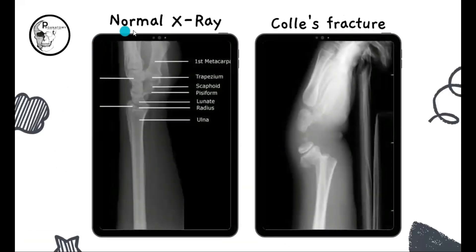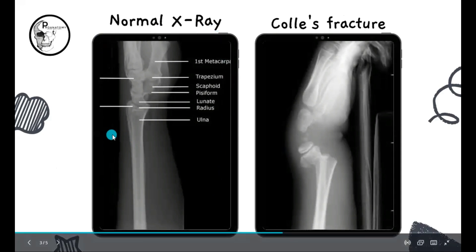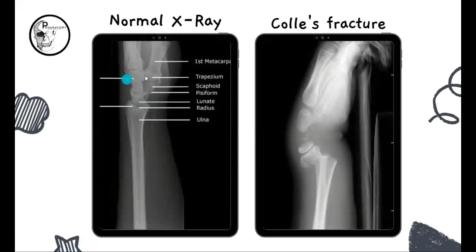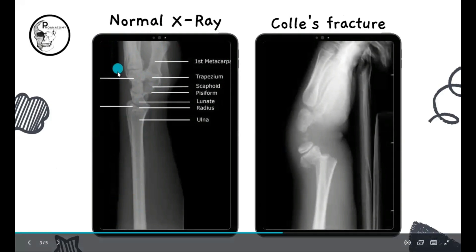Before going to that, we will see the normal X-ray of the radius. Here you can see the lower end of radius, and this is the palm where you can see the carpal bones. This is the ventral aspect of the palm or the palmar surface, and this is the dorsum of the hand. You can see the soft tissue line — it is almost a straight line here.